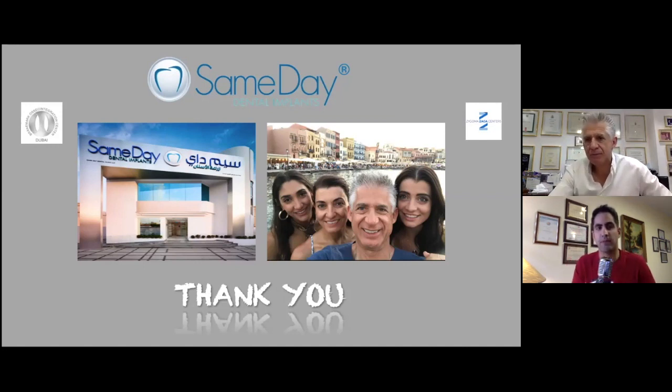And I think for the audience, it's pretty clear. And for osseodensification, it's very important for them to have the guidelines available for each dental implant system on the website, and to go exactly with the numbers. It's not like normal implant systems, where you start from 2 and end at 4. In different systems and different cases, for example in sinus, it's different compared to expansion. So they should exactly follow the protocols, right?